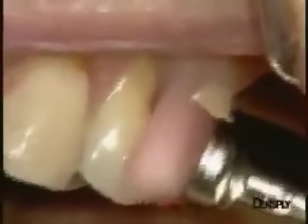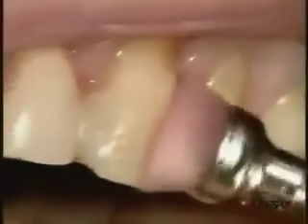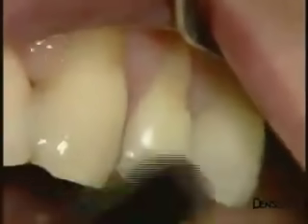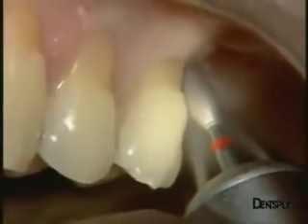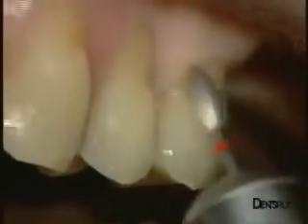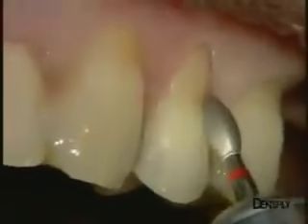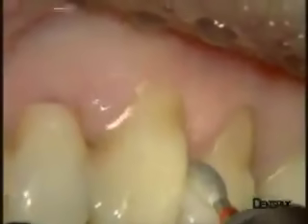The first stage consists of very carefully cleaning all the surfaces to which the adhesive will be applied. We are using the well-known prophylaxis paste Nupro, which is very effective to remove any unsightly discoloration. We bevel the enamel on all teeth to be treated using a red ring ovoid diamond burr. The burr is held at 45 degrees, and the ovoid shape gives a good view of the preparation limit, but also a sufficiently instrumented surface that ensures good adhesion and avoids secondary discoloration.